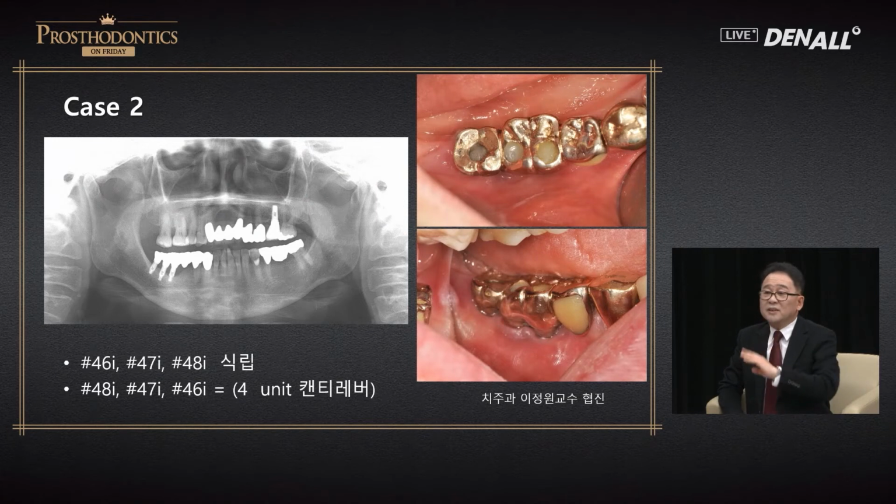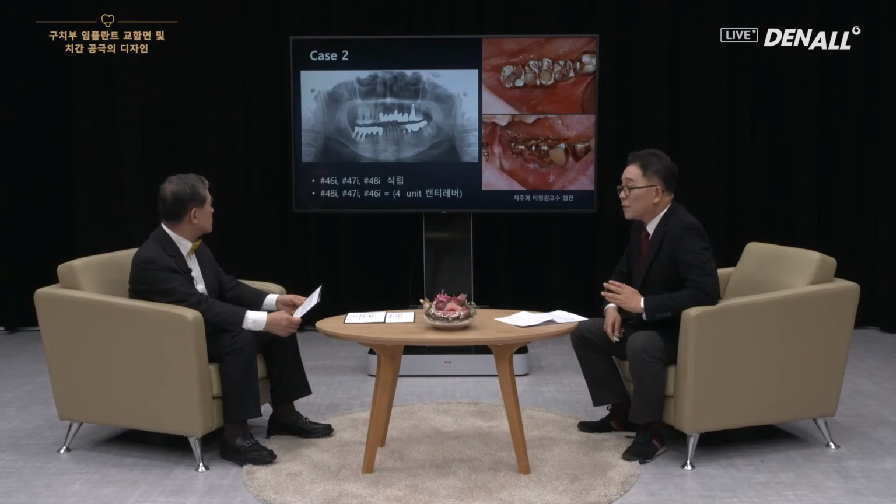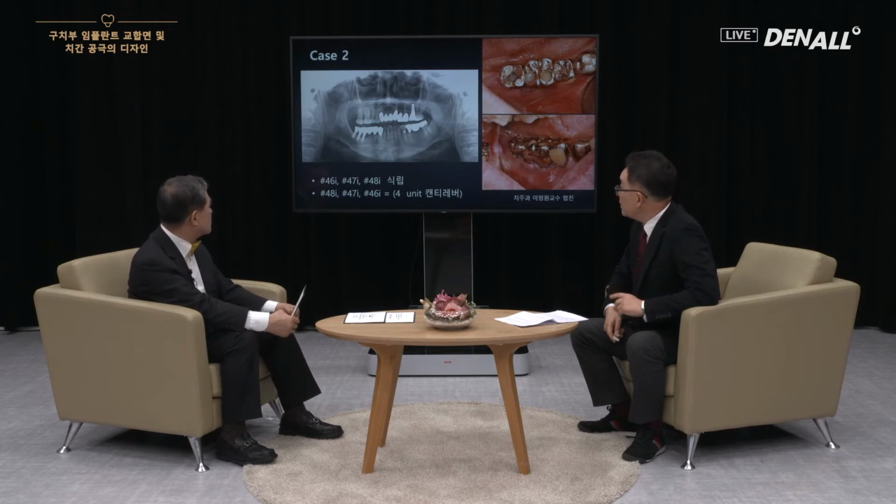And the distance between the implants is very important. I have a lot to talk about this 4-unit implant. I wonder why there's no implant placed at number 5 in the picture, the most mesial implant. If that one is good, the middle one could have been removed. This is an economical problem as well, so the patient wanted to keep it.